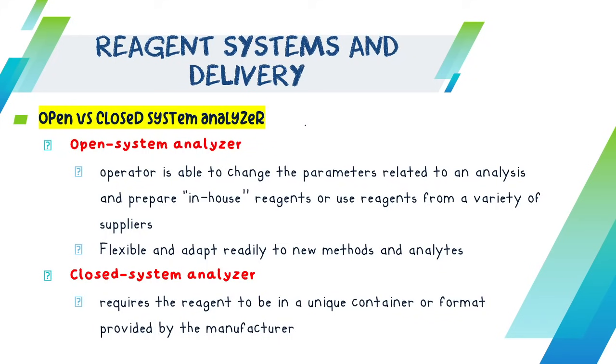So, for your closed system, that is actually one of its disadvantages in terms of flexibility. However good the hardware and software already installed in your closed system analyzer, you cannot change them, not unless it is from the same manufacturer. You don't have your own freedom; if you want a certain style for your analyzer but it belongs to another manufacturer, you have no choice and cannot change it.